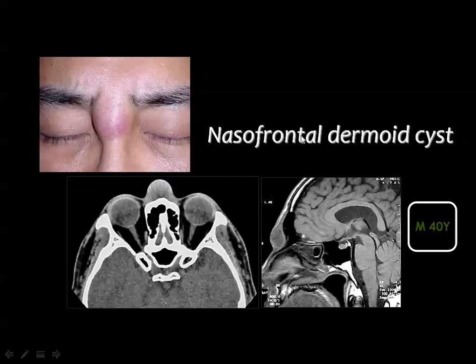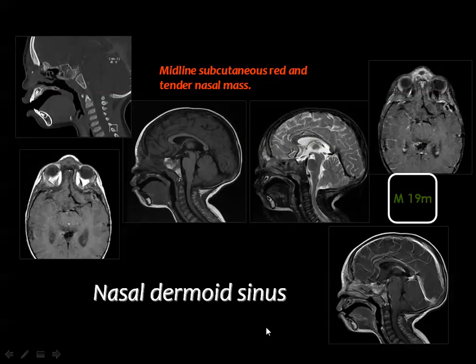This is a proved nasal-frontal dermoid cyst. Because fat is absent, it enters the differential diagnosis. Whenever fat is visible inside the lesion, that is a diagnostic criterion for dermoid. When the dermoid sinus is infected, you get enhancement, demonstrating the value of contrast-enhanced CT or MRI. On a sagittal reconstructed CT image, you can see the defect at the region of the lesion.